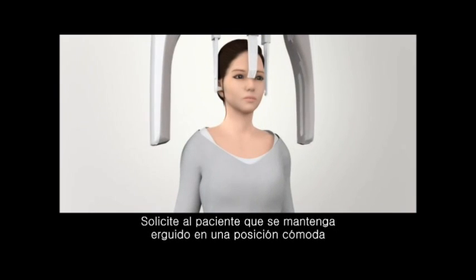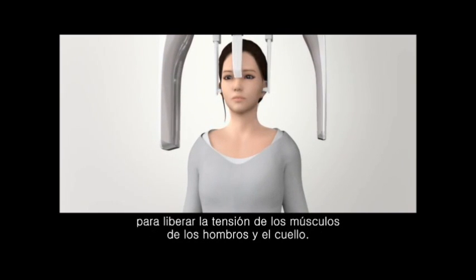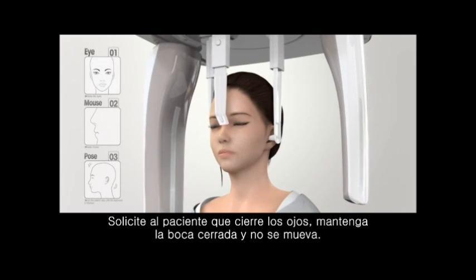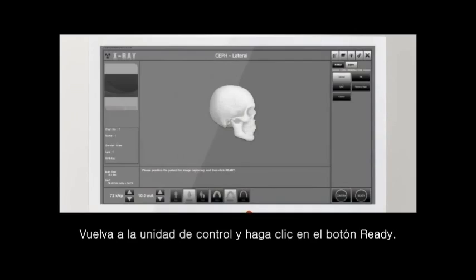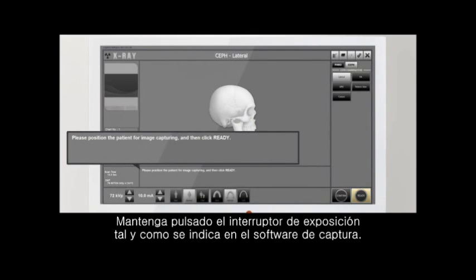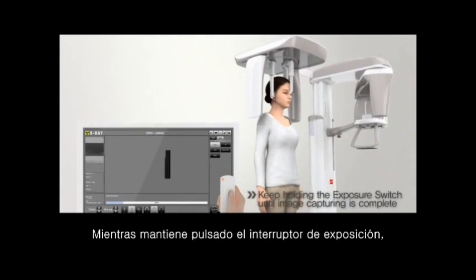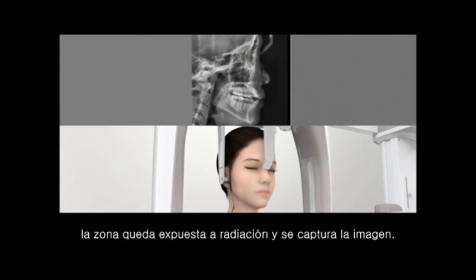Ask the patient to stand straight up in a comfortable position to release the tension in shoulder and neck muscles. Ask patient to close eyes, keep mouth closed, and not to move. Back to the control unit and click the Ready button. Press and hold the exposure switch as the guide in capture software. While the exposure switch is held, radiation is exposed and proceeds taking the images.